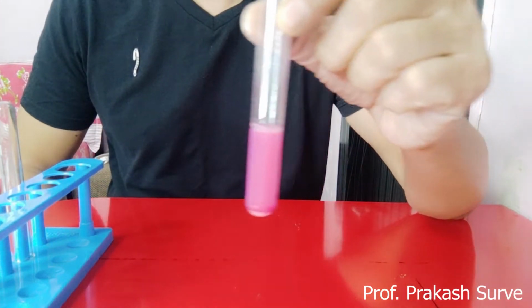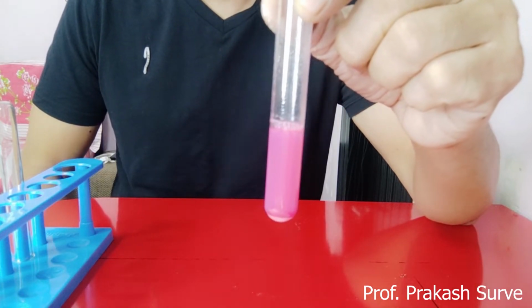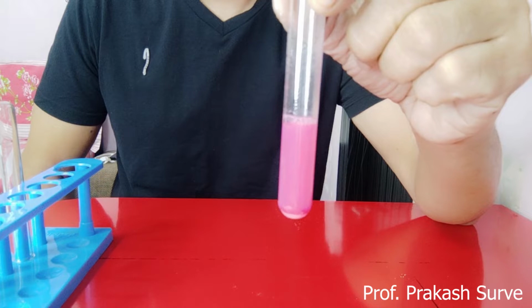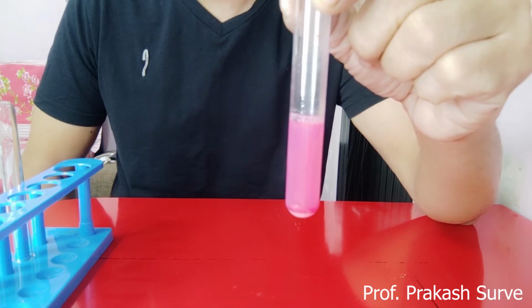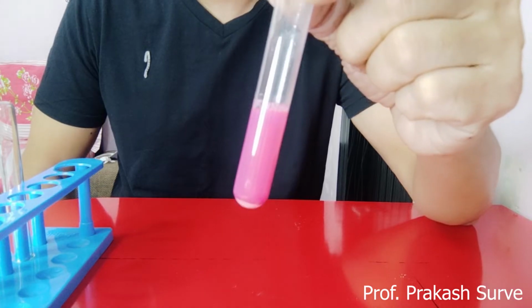Now we'll observe the result after a few minutes. After a few minutes we got this color. So here the observation is that the mixture turned pink. The conclusion is that urea is present in the given urine sample.